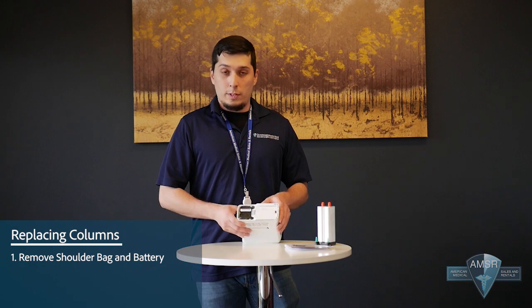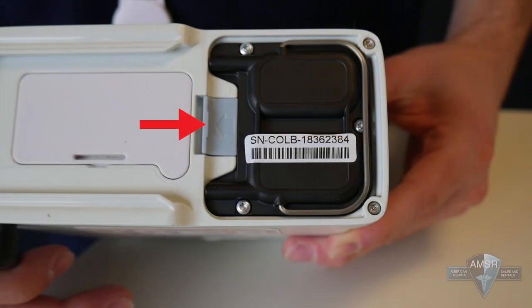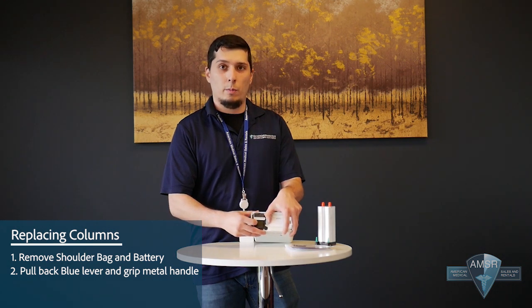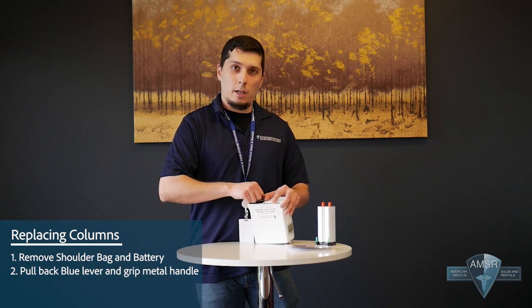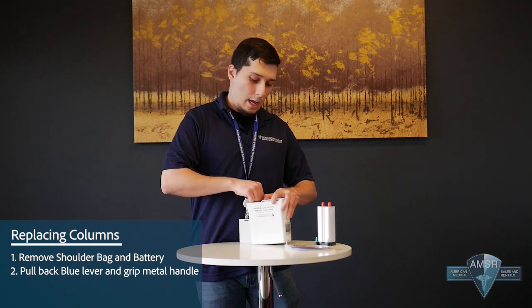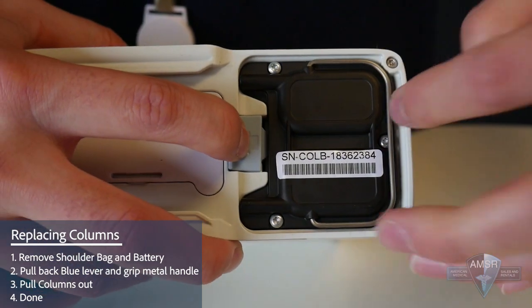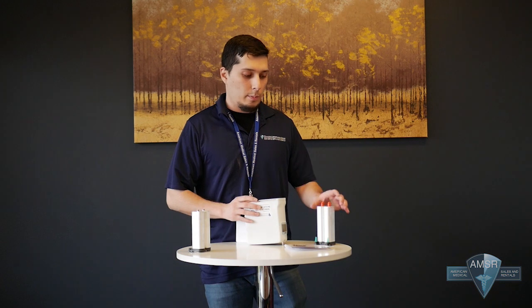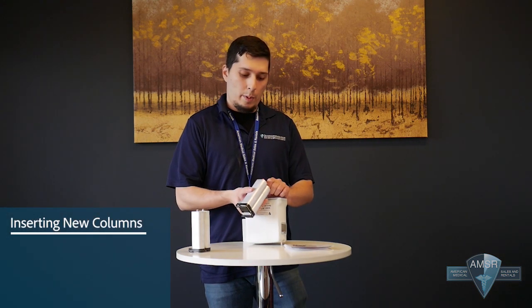You would have to take it out of the bag, remove the battery from the bottom, and where the battery sat is a blue lever, has an arrow on it, and also a small lever on your old columns. So in order to remove these columns, you're going to depress the lever with the arrow on it, get a solid grip of the handle. You always want to be on a steady surface when doing this, and pull the columns out as shown. So in order to insert the other columns, exactly as is, but putting them back in.